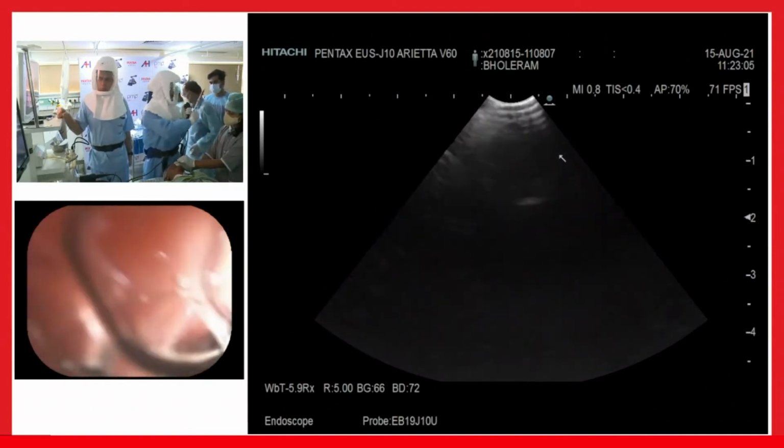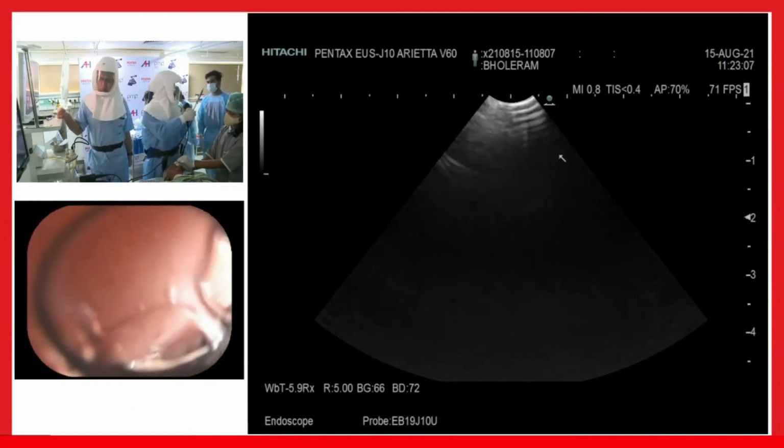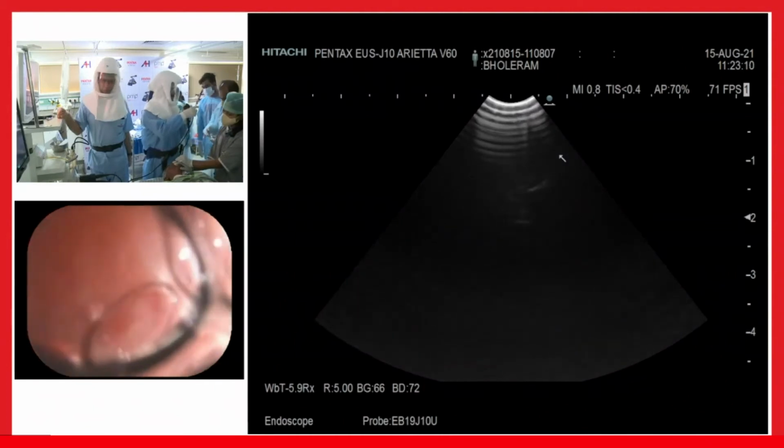And sometimes you find difficulty, always remove this sheath, this needle.